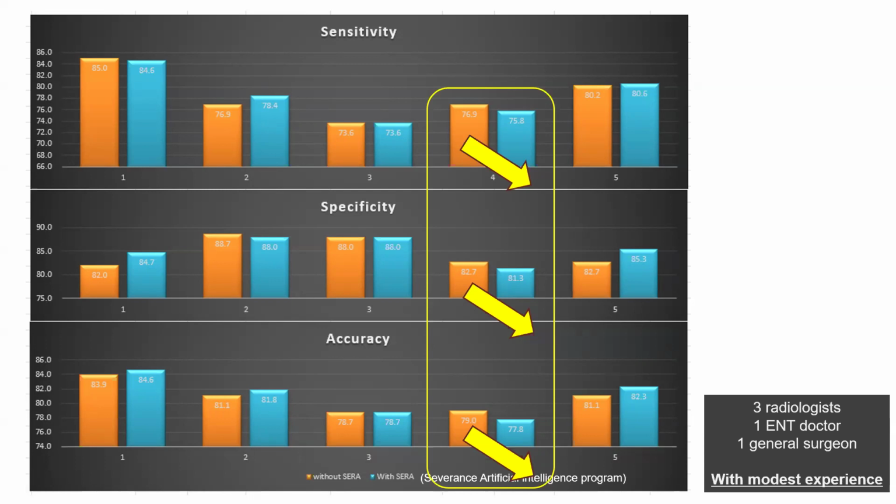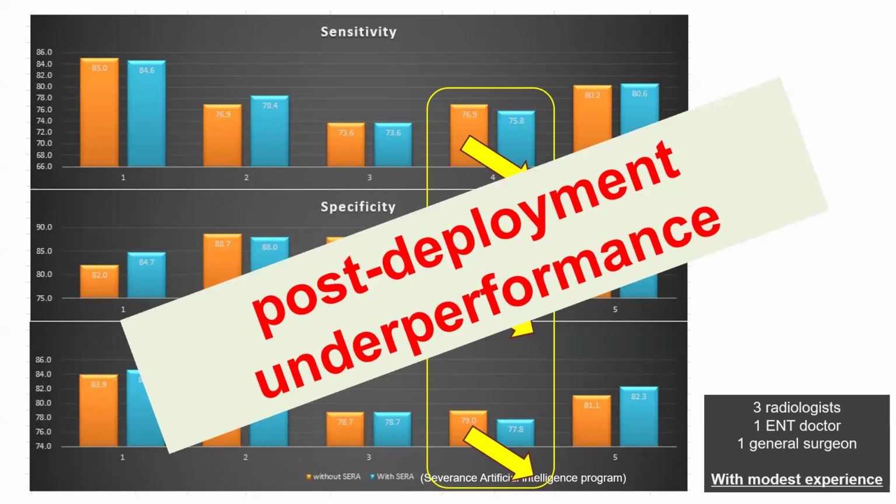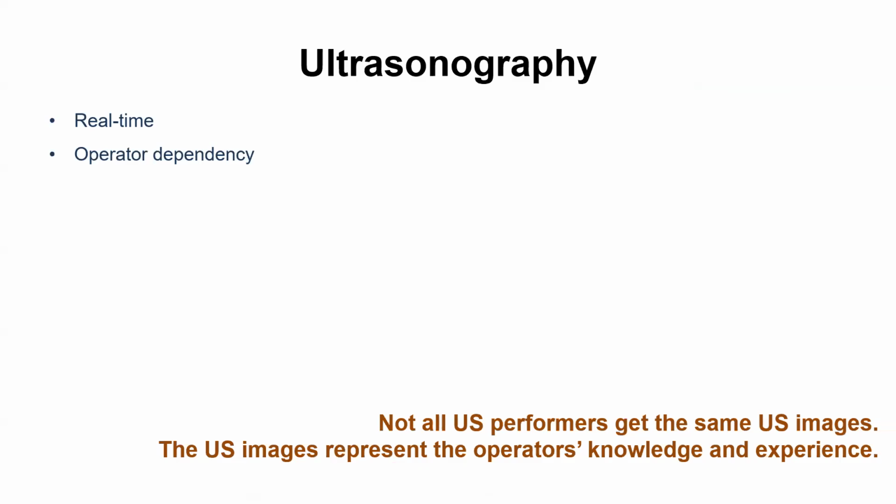If you're concerned about integrating AI tools into clinical workflows, you should consider the possibility of post-deployment underperformance. As you know, ultrasound is an operator-dependent tool. Therefore, not all ultrasound performers get the same ultrasound images. The ultrasound images represent the operator's knowledge and experience.